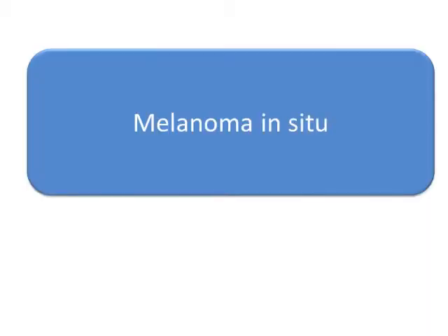Another case here — clinically a pigmented macule. Dermatoscopically, you see a structureless pattern, but you also see circles: gray circles, some brown circles, and some semi-circles, which are called asymmetric follicular openings. And here also some circles, and these circles are a good clue to lentigo maligna melanoma in situ.